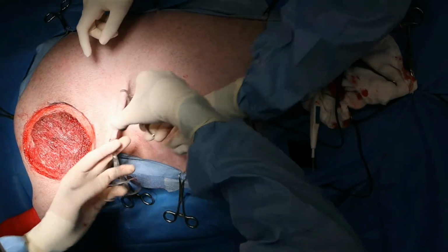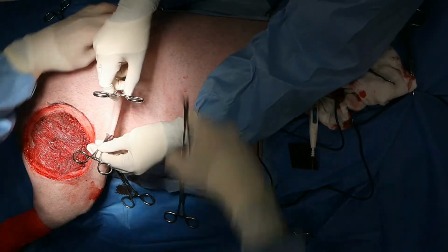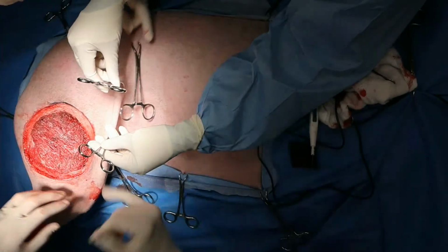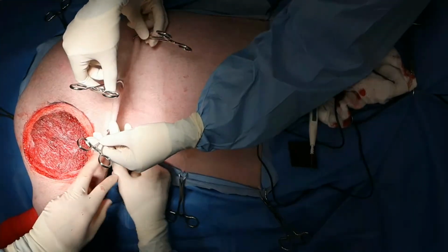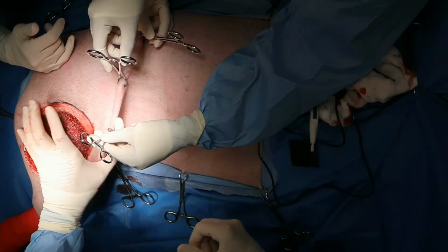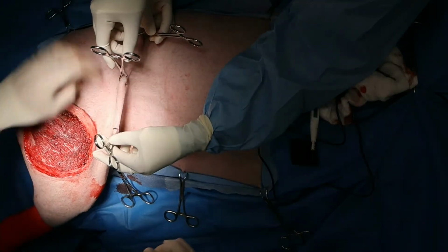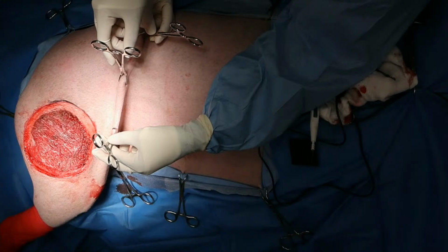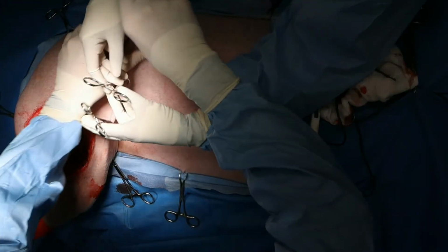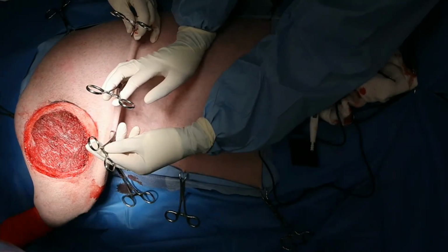So this is the flap that I'm taking, kind of like this. And lengthwise, basically, we need to measure the distance from this corner of the flap here to the farthest reaches of the wound, which is up to about there. So that'll cover it. And we'll lift that up. That's getting a bit tight up there. Lift that up a little bit more there.